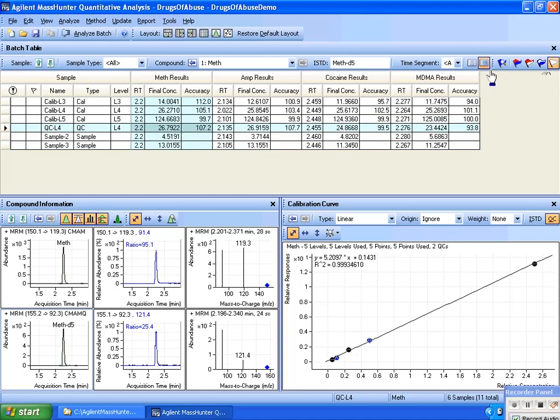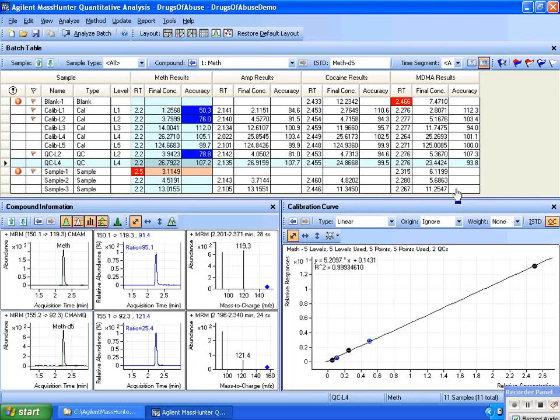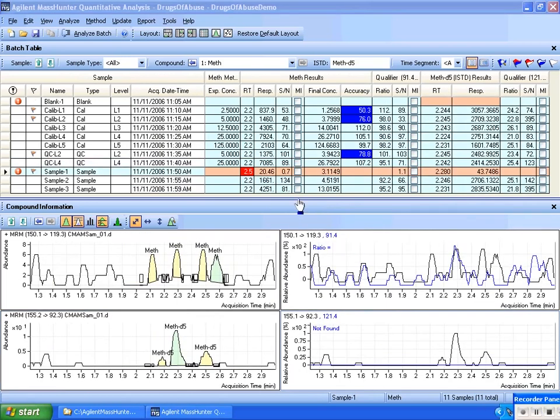So the push buttons on the outlier toolbar give me control of filtering the samples, and I think that you can appreciate how that can help you zoom in on samples so that you can get your analysis done faster. Let's take a look at the sample here, sample 1. Now, if I look at methamphetamine, look carefully at the ISTD, methamphetamine deuterated compound, I'll see that I've gotten an ISTD response that's quite low. I go over and look at the strength of that signal, you'll see that it's quite low.